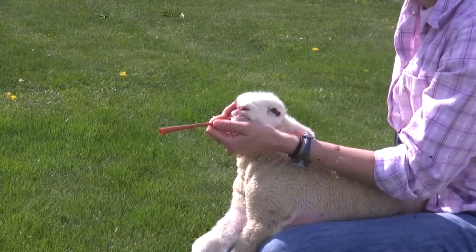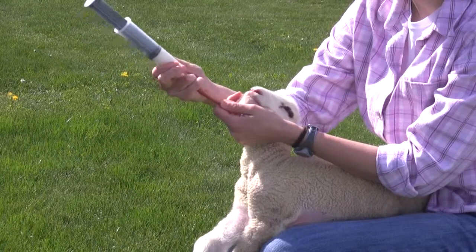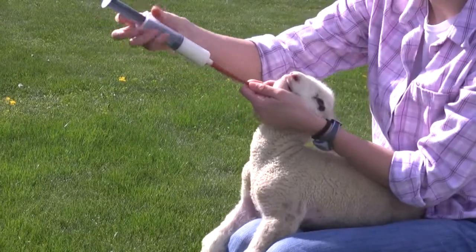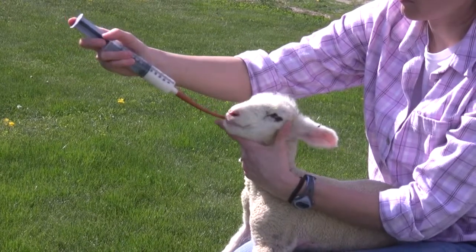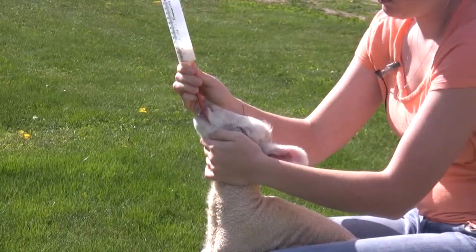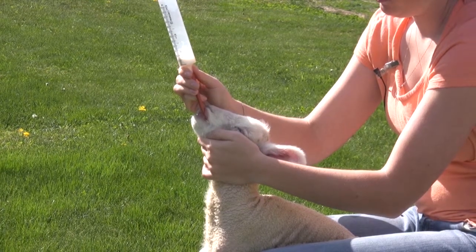Once the stomach tube is properly placed, remove the syringe and fill it with milk. At this point, you have two options to administer the milk. The first option is to slowly depress the plunger. The second option is to leave the plunger out and allow gravity to push the milk through the tube. Either of these methods are acceptable.